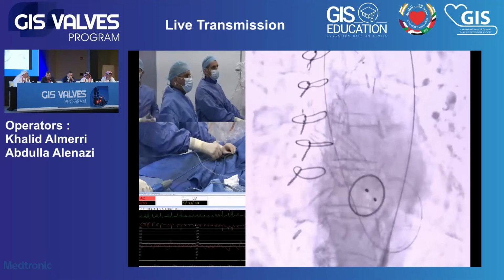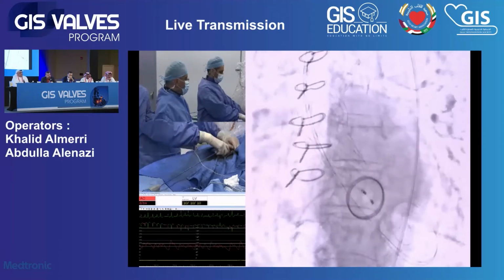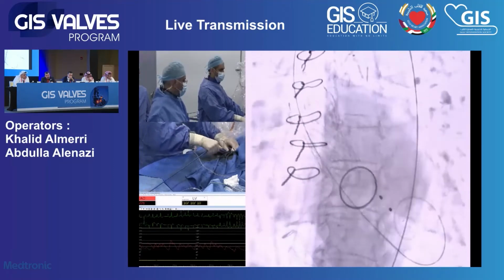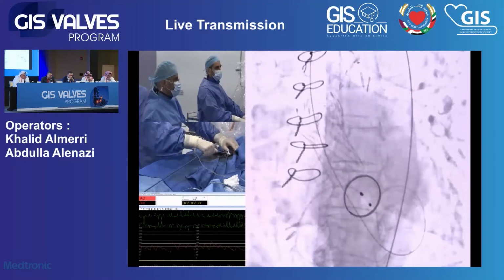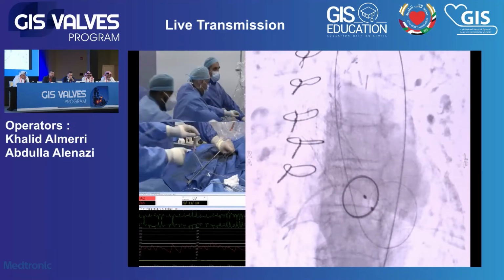Also, it's very nice that they waited quite longer than usual because of the high implantation, just to make sure that this valve was not dislodged. And this is really... I mean, we should give time in this case, for sure.